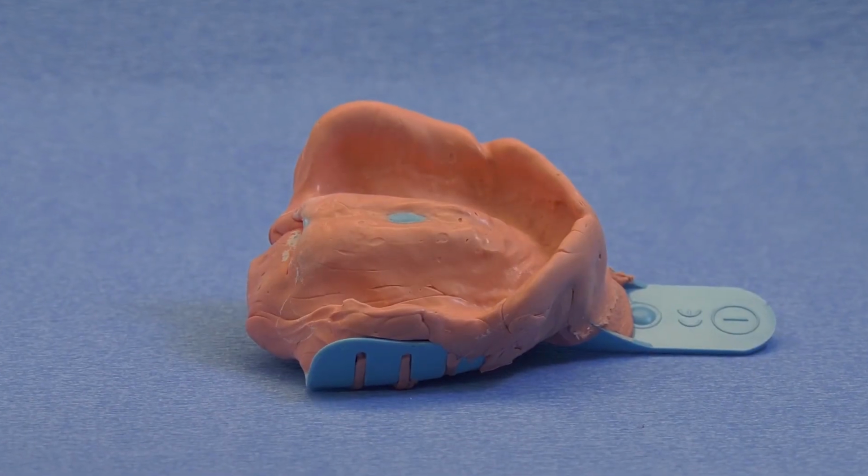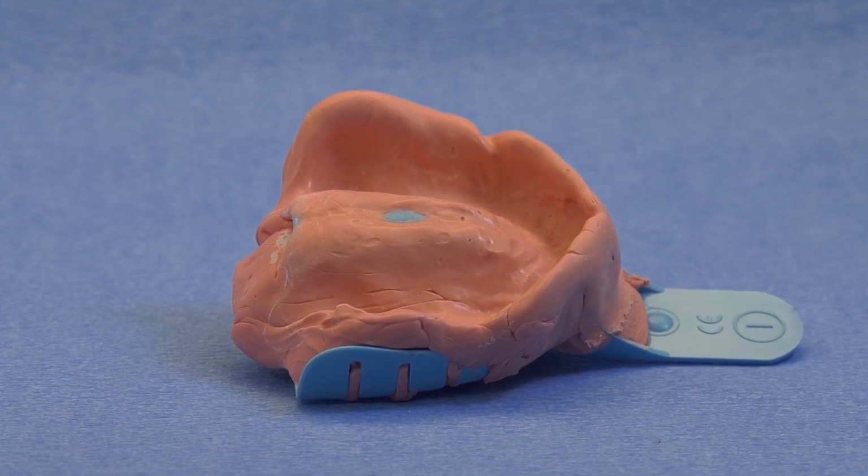So, the steps involved in proper planning and processing of a fixed roundhouse restoration, whether it's a detachable fix-on-6 restoration or a cemented fixed on 10 or 12 restoration, is this. Number one, proper planning of the placement of the implants is of utmost importance, which means send in either your good quality impressions and a CT scan or a good quality panoramic x-ray along with good quality impressions, or if you have digital impressions, that's great too.